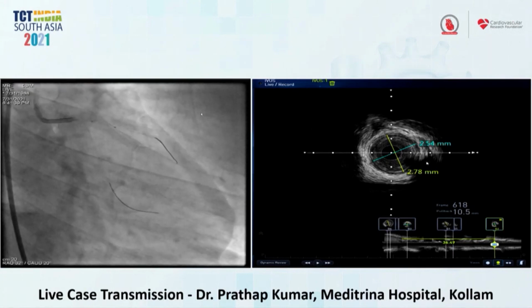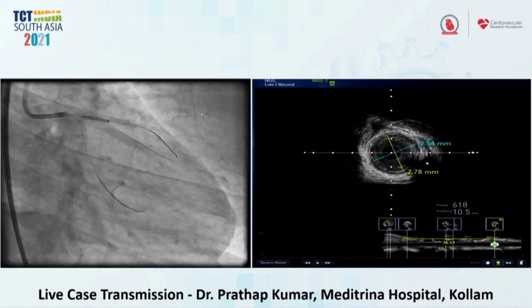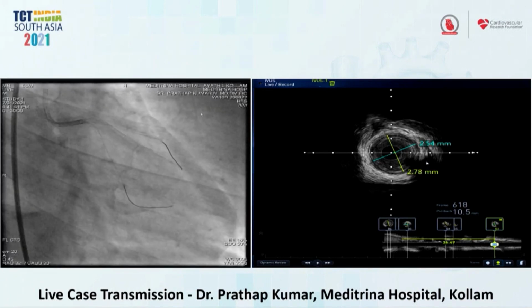Actually, Sanjog, you can make comments. So I was going to ask you actually, and Dimitri, please let me bounce this off of you. Do you routinely, once you've crossed and externalized, take a dual lumen catheter and flip antegrade, get rid of your retrograde gear? Or do you generally do your work on your externalized wire?